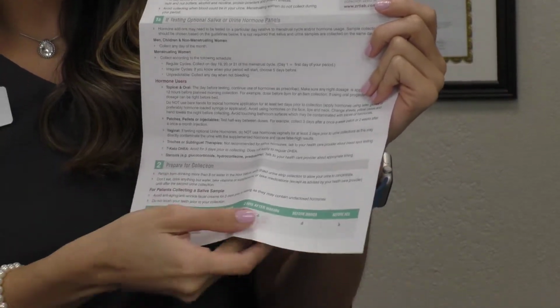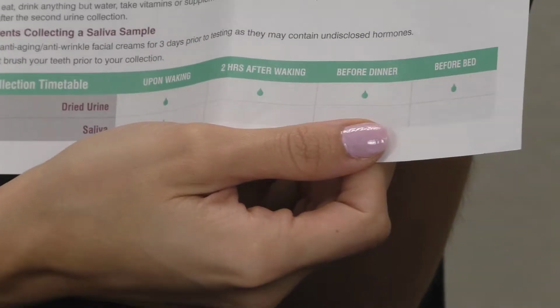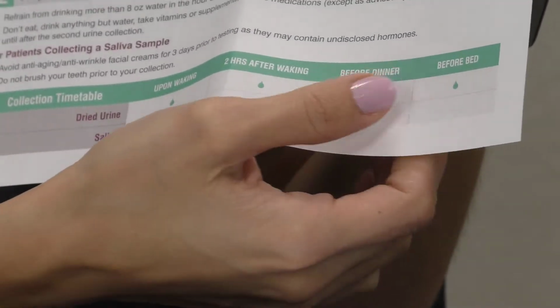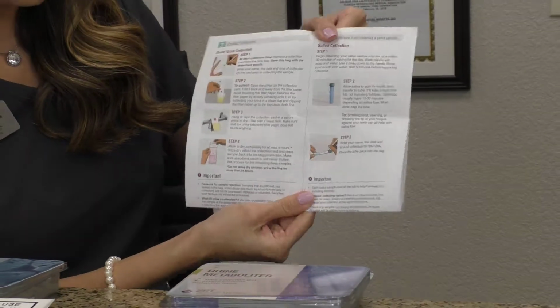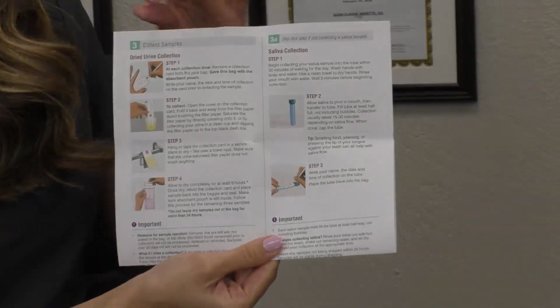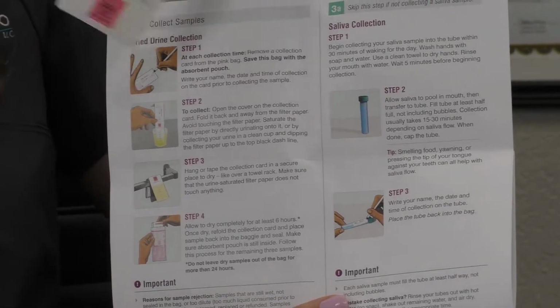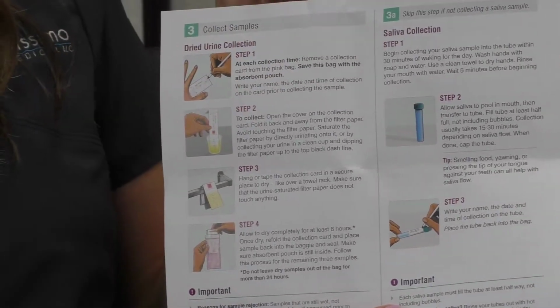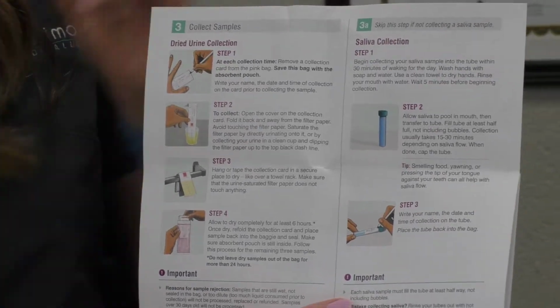Then you're going to have a sample that's 2 hours after waking, a sample before dinner, and a sample before bed. So that's 4 dry urine samples. So I'll show you here on the back. We already pre-labeled all our samples here. So we filled out our name, the date, and the time that we're gonna do this sample.